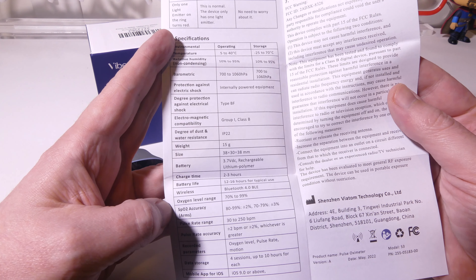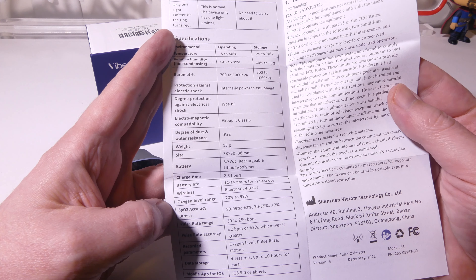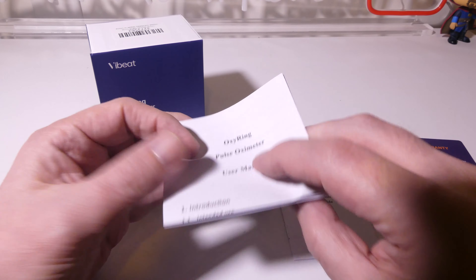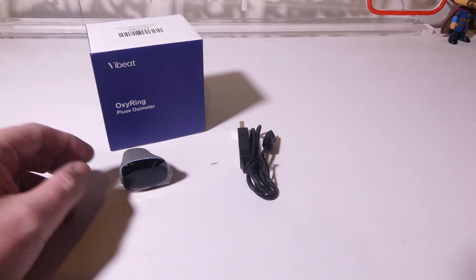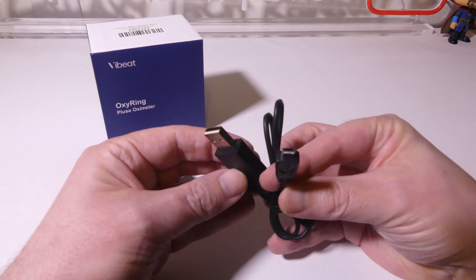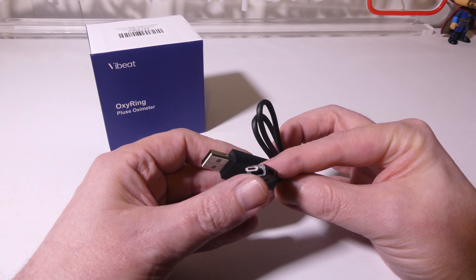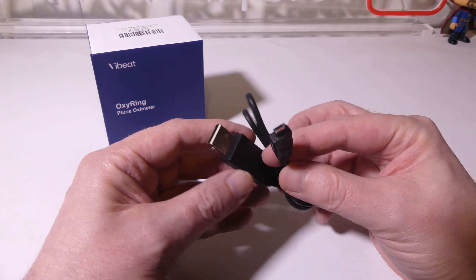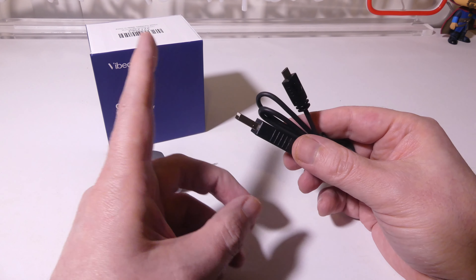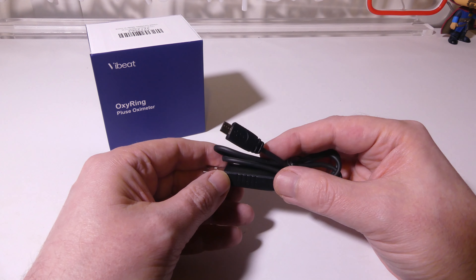The user manual for the OxyRing is written in English. It's well laid out. There are some specifications here that I will leave up, so if I miss anything, you can come back to this point in the video and check it out. It takes a little over two hours to charge and you will get 12 to 16 hours of typical use per charge, so this will definitely last overnight. It runs on Bluetooth 4.0 low energy and you can check out the rest of the specs if you need to.